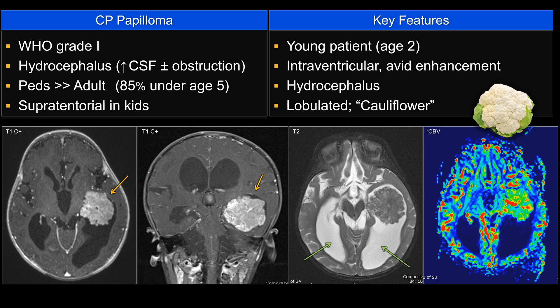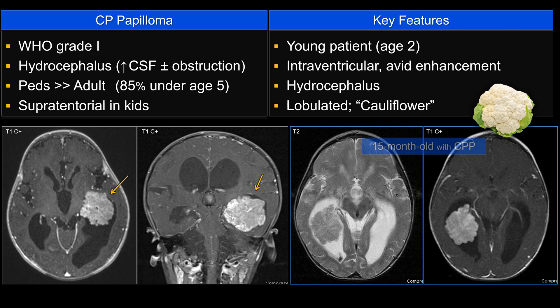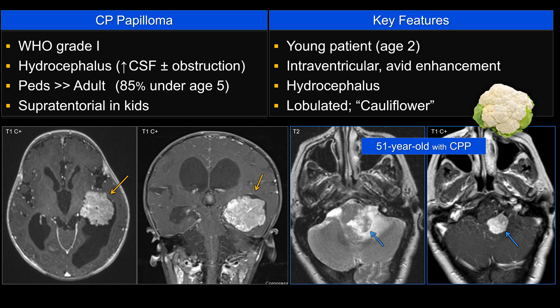As a kid becomes older and into adulthood, half will be supratentorial and half will be infratentorial. So one of the differential diagnoses in an adult with a fourth ventricular intraventricular tumor, I would think about choroid plexus papilloma also. This is another example of an older patient with biopsy-proven choroid plexus papilloma in the fourth ventricle, expanding into the left foramina of Luschka — it is in the location where you expect to see choroid plexus.